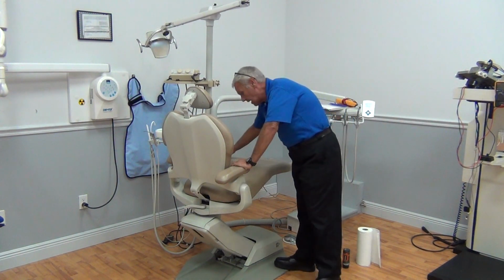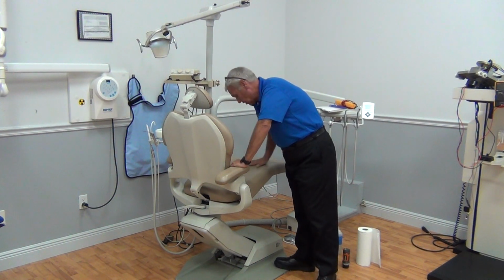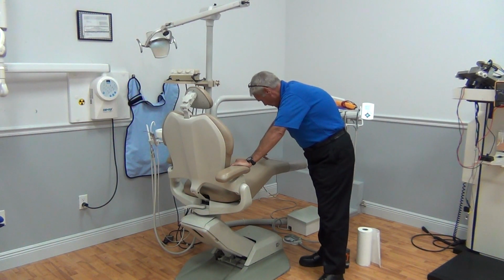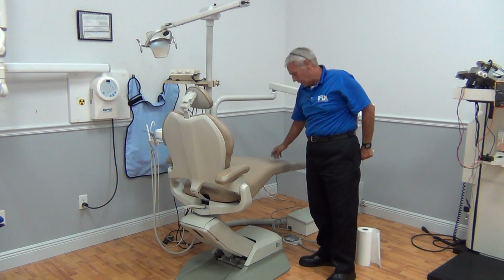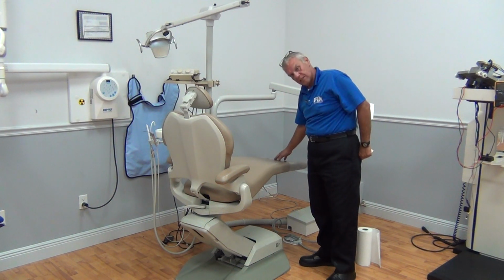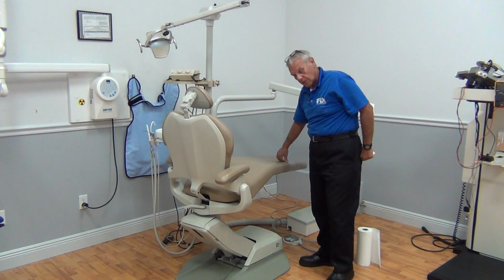We're going to check our lounge cover or our seat rest for stability. Very stable. We're going to check our clear plastic scuff cover or foot guard for integrity, waves, scratches, scuffs. Even if you don't make an upholstery sale, this is an easy sale. These are available from RPI, Pelton, DCI. Most of our vendors will sell a clear scuff guard.